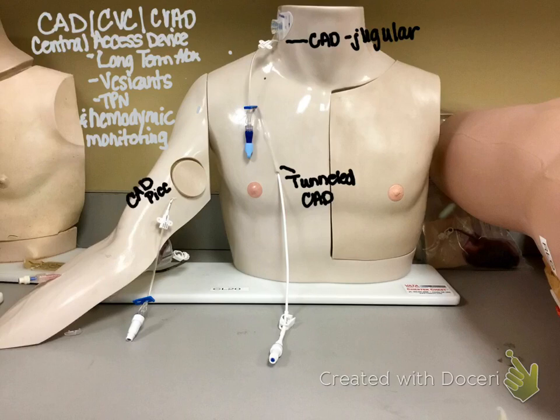And then you've got your PICC, which you're going to see a lot of. PICCs are usually in the arm. They're not always up high. Sometimes they're up here, sometimes they're down here, sometimes they're here. So you may see different PICCs. You may see more than 1 lumen, you may see 1 lumen. Same thing, you're probably going to see a stat lock or sutures holding that in.